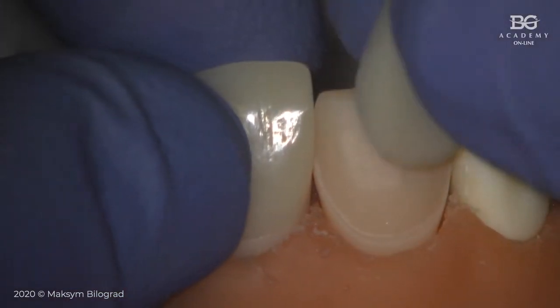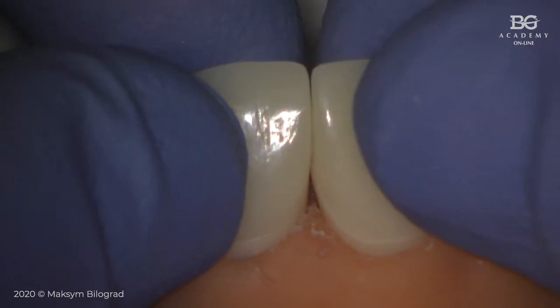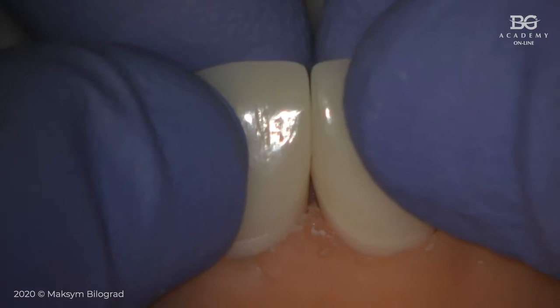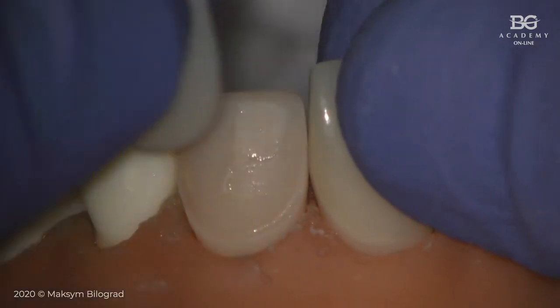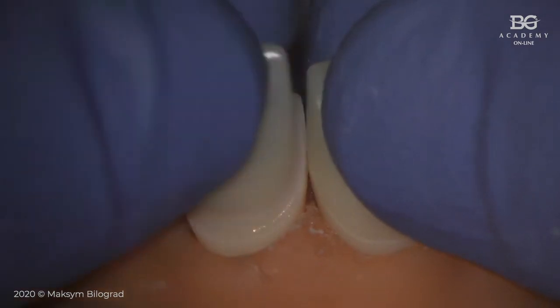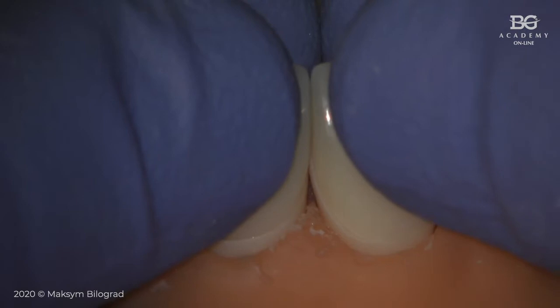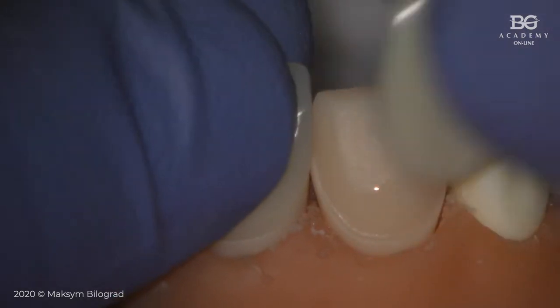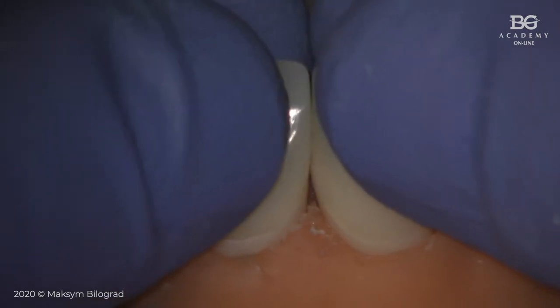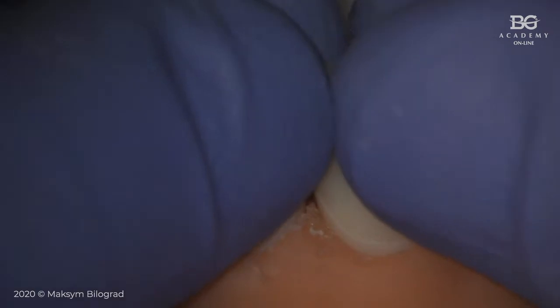And then look what I will do. I will take my first veneer, will put here, and if I can see that I cannot fit my veneer because of the tight interproximal contact, I will take out the second one, and now yes, it fits. Now this doesn't fit. Remove this one, it fits. Go one more time, doesn't fit. This, yeah, fits. So see, there is a problem of tight interproximal contact here.